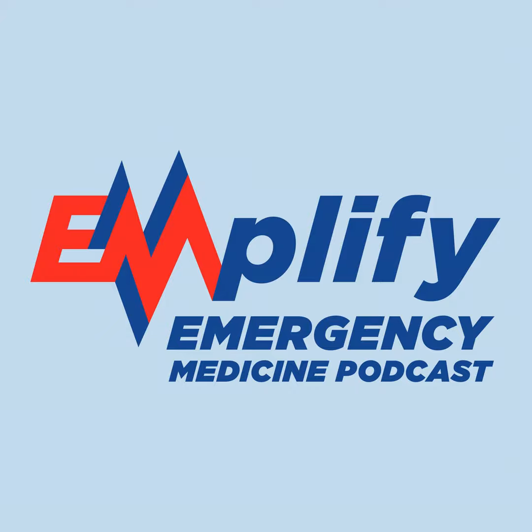And so, I've had patients who had almost certainly pulmonary emboli as the etiology of their arrest, and we needed time to circulate the thrombolytics. And so we actually just kept them on the Lucas, and their end-tidal CO2 was 10. And we were just like, we're just going to let it go. And we're not going to do pulse checks if the exhaled CO2 remains 10, because it is unlikely at that pulse check that we would have a pulse, but we would be stopping circulation of our thrombolytics, which might actually have a possibility of allowing for this patient to eventually get return of spontaneous circulation.